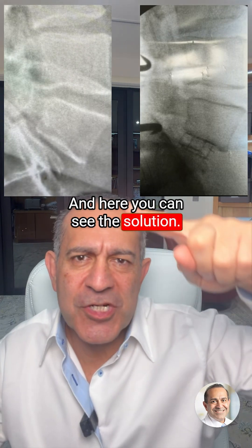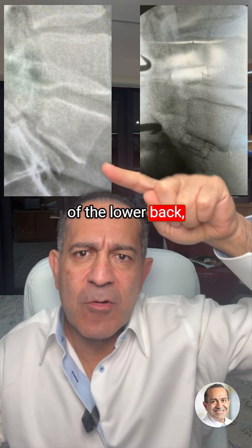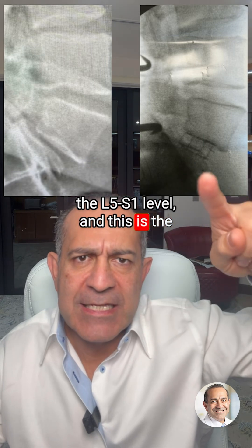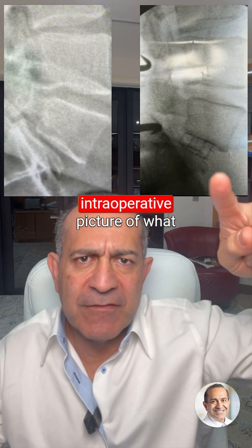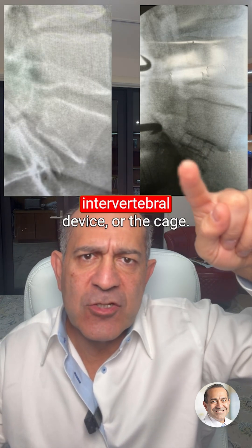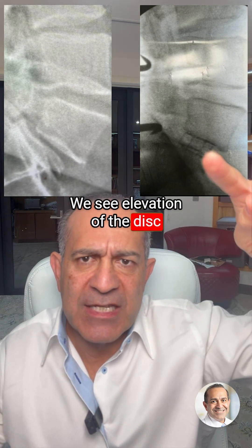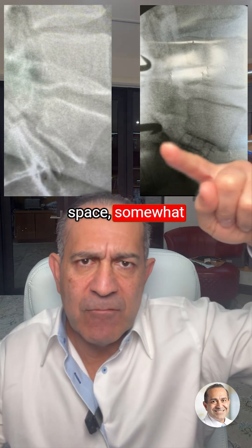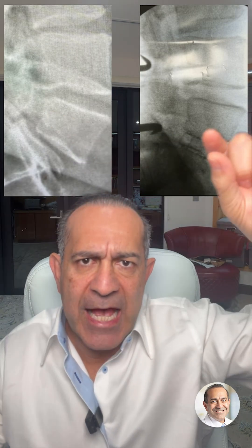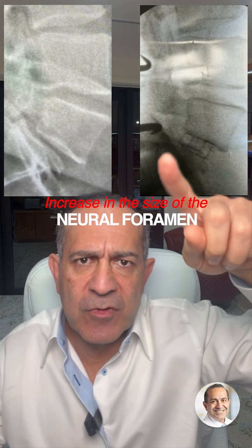Here you can see the solution. The preoperative x-ray of the lower back at the L5S1 level, and this is the intraoperative picture of what happens when we put this intervertebral device, or cage. We see elevation of the disc space, somewhat reduction of the spondylolisthesis, and increase in the size of the neural foramen.